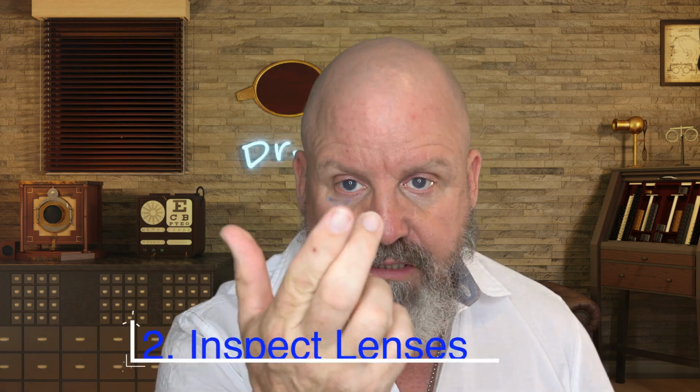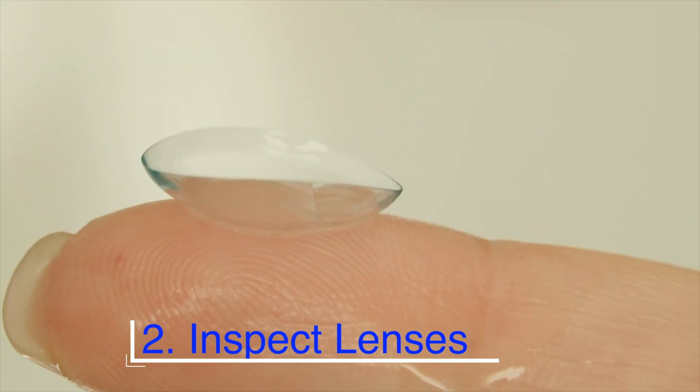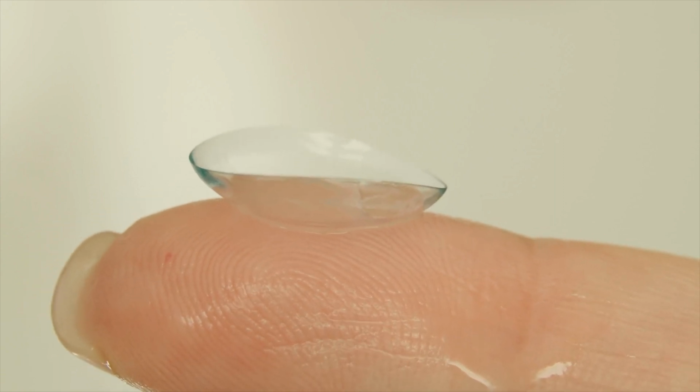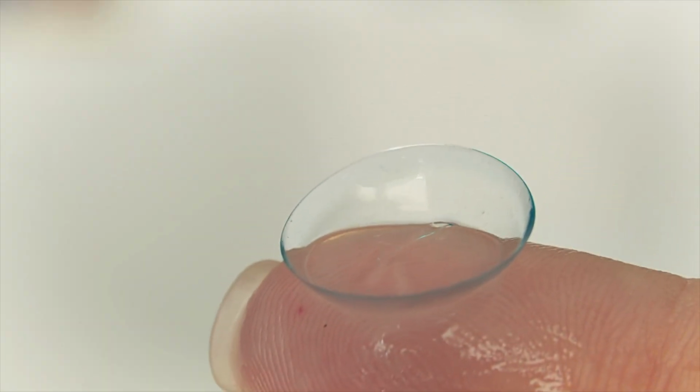Number 2 is to always inspect the lens to make sure there's no debris or anything on it or a rip or a tear that could be an issue once you put it in. Number 3 is preparing that lens to put it in.